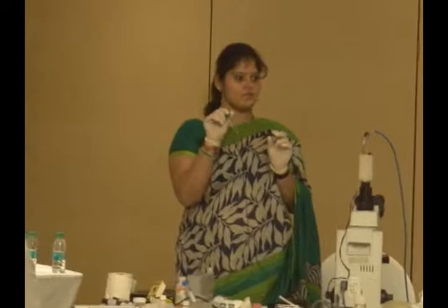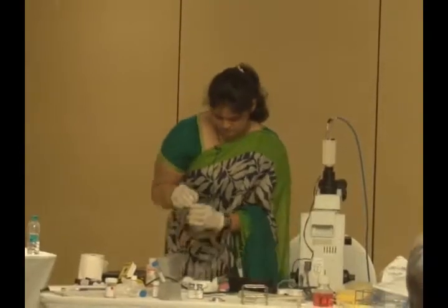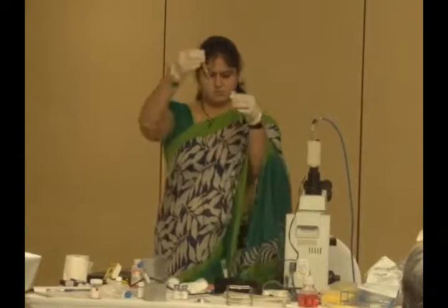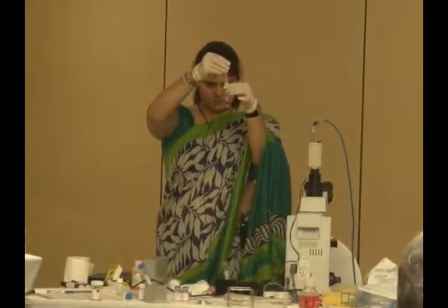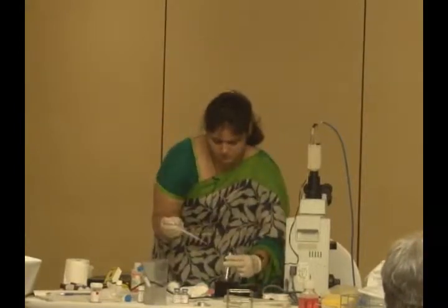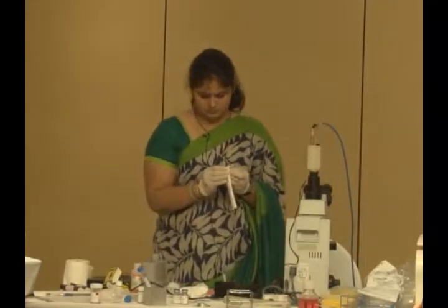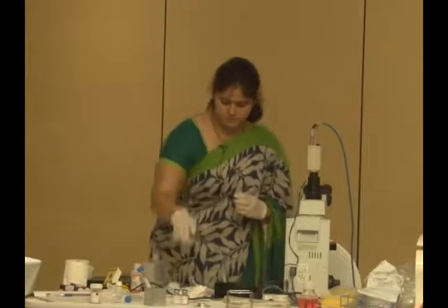Take the conical tube because we are going to centrifuge this. Add sperm wash medium. 2 ml of this sperm wash medium.